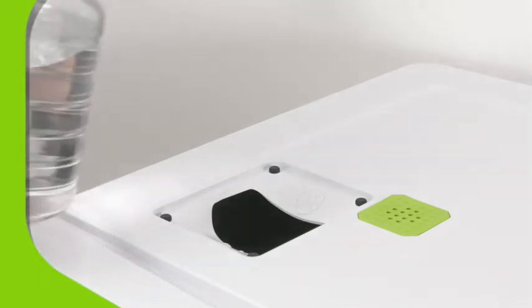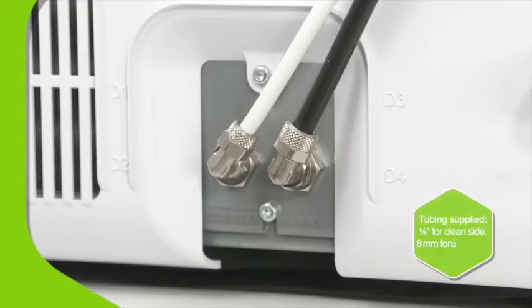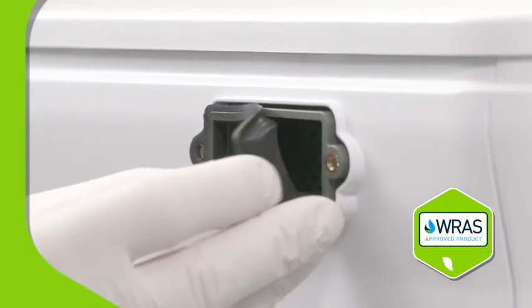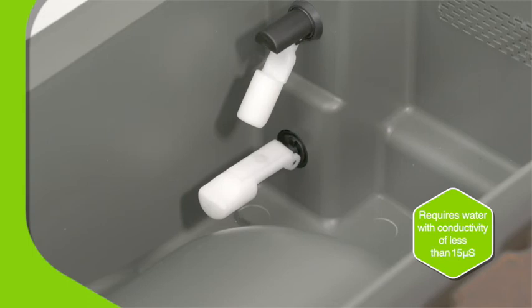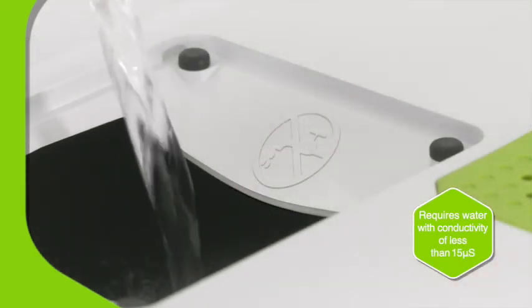For manual filling, an integrated funnel with a wider opening prevents splashes. Or you can use the automatic fill and drain function, which requires a pressurized water source. The built-in air gap prevents the backflow of fluids to satisfy legal requirements. A built-in water quality sensor ensures the correct water is used, extending the service life of internal components.